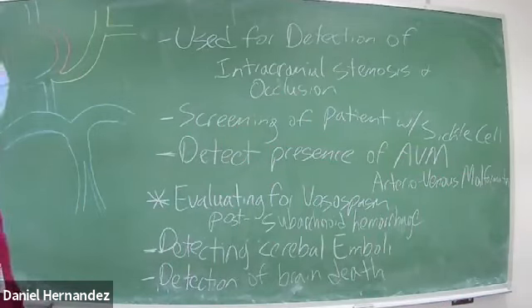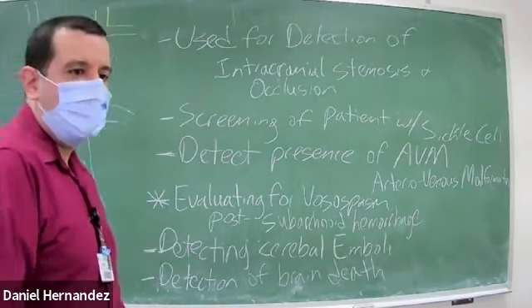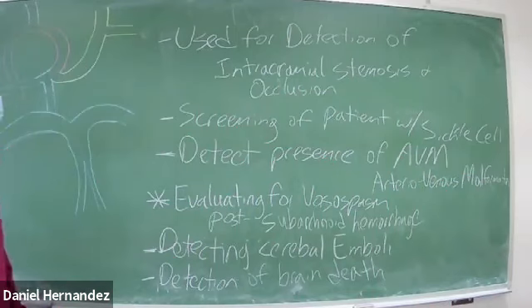So in essence, this transcranial Doppler exam gives us a good overall indication of brain perfusion.